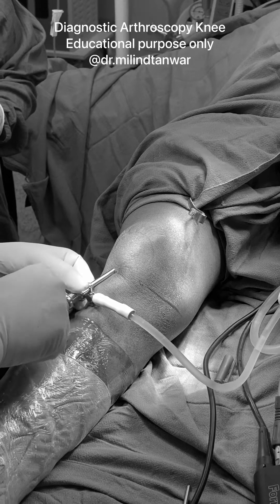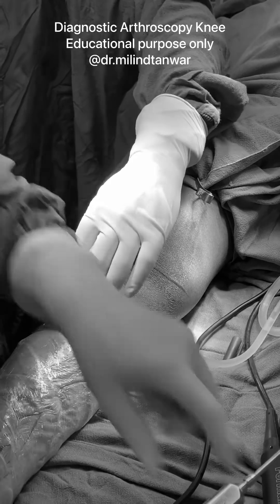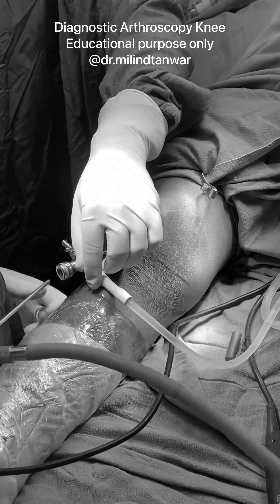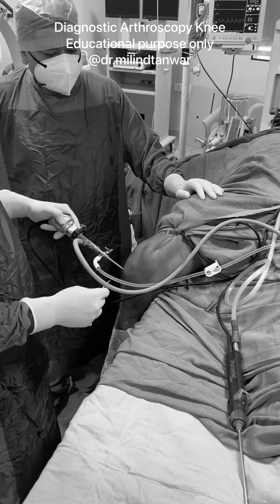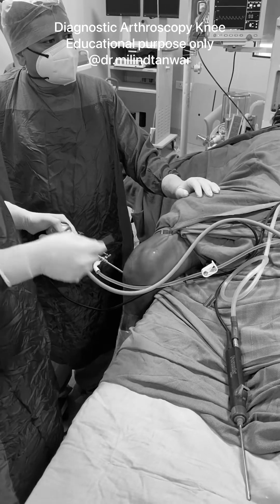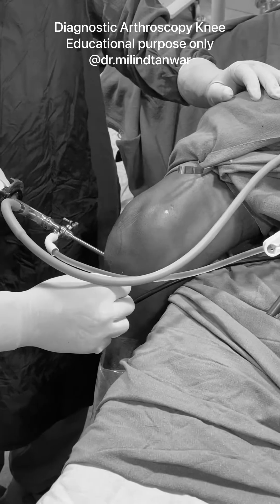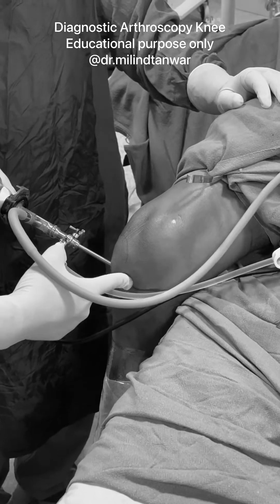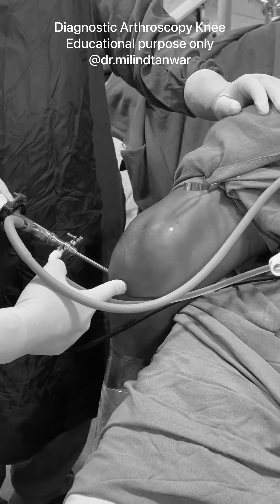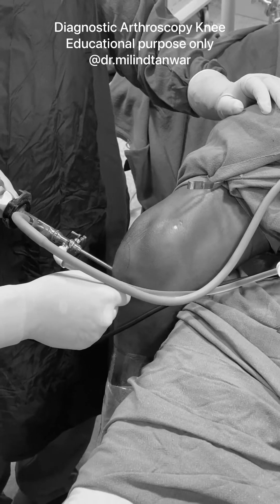We will start the diagnostic arthroscope. The second part is where we are doing our diagnostic scoping and now we need to make our medial portal. Absolutely in line with the lateral portal, you can feel the soft spot just underneath the patella at the joint line level. You have to insert the needle as shown in the video.